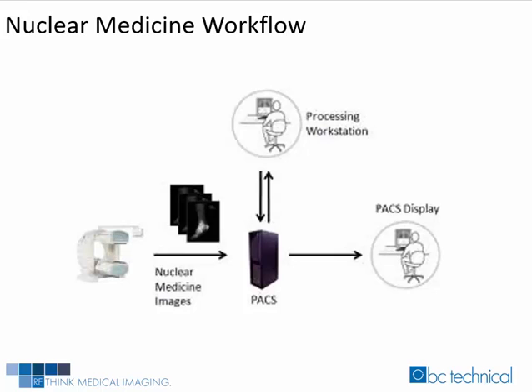After the scan is completed, the study is exported to a post-processing computer for any study-based results or processing. After post-processing, the study is transferred to a PACS for storage and for physician interpretation. Now, this workflow is a generic model of what happens before and after a patient study, but you can see how information is transferred electronically via every step of the workflow.